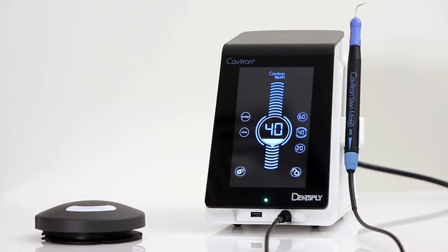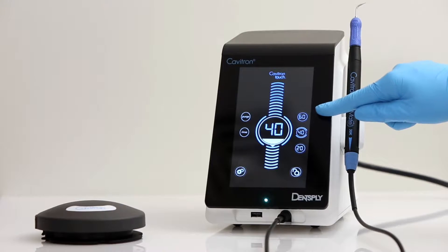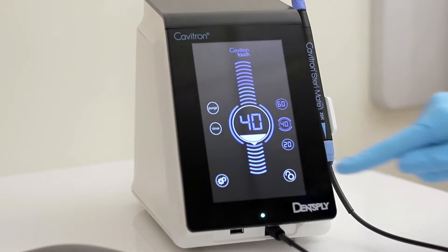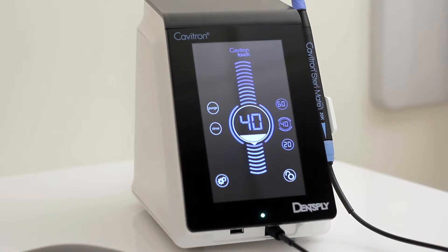The right side of the screen contains 3 preset power settings that come factory set to 20, 40, and 60. However, these can be reset to any level desired. The settings icon accesses the menu allowing for syncing of the foot pedal to the unit, brightness setting, and the tap-on foot pedal control setting.